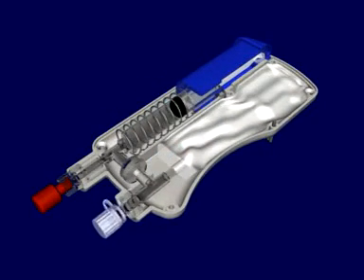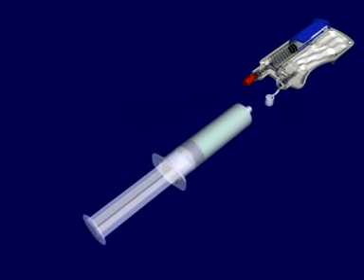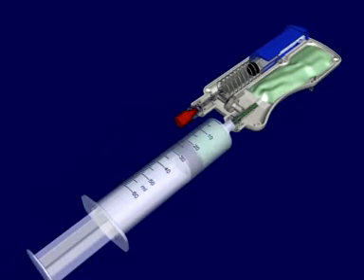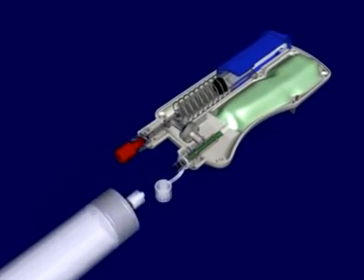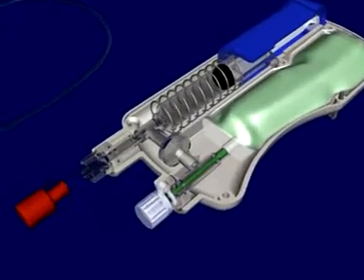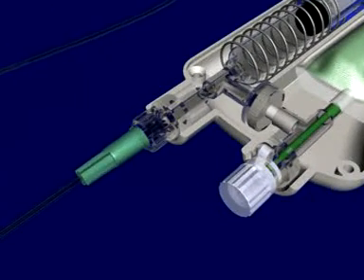First, remove the cap on the fill port and attach a 60 cc syringe filled with 50 cc of a local anesthetic, such as 0.25% bupivacaine. Next, inject the 50 cc of the local anesthetic into the fluid reservoir. Detach the syringe and reapply the protective cap to the fill port. Attach the tube extension set to the PC2000 at the outflow port labeled cath.